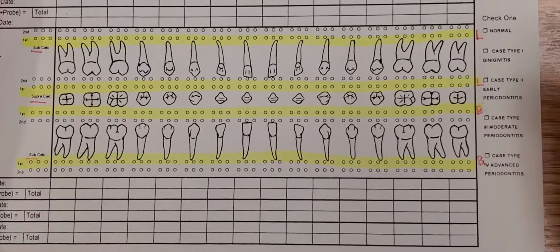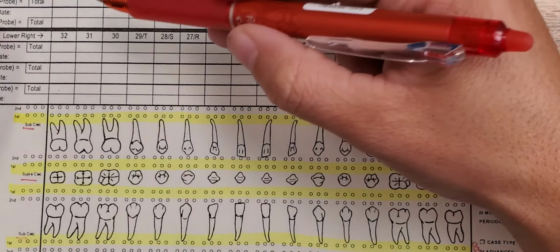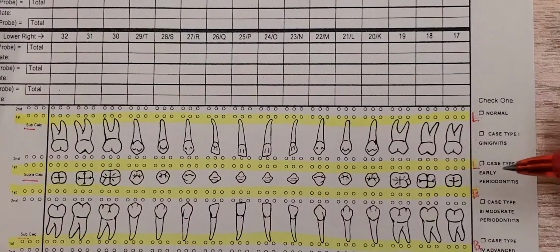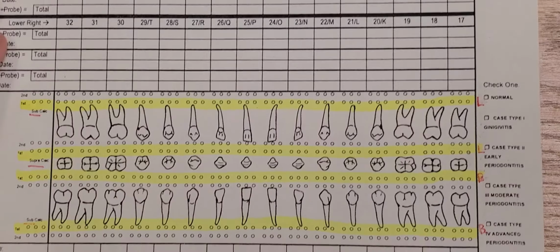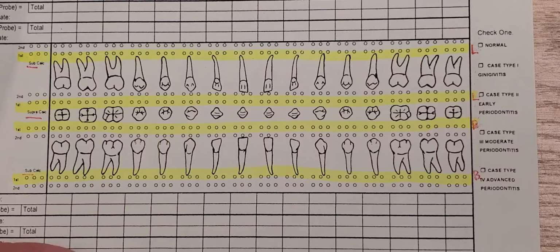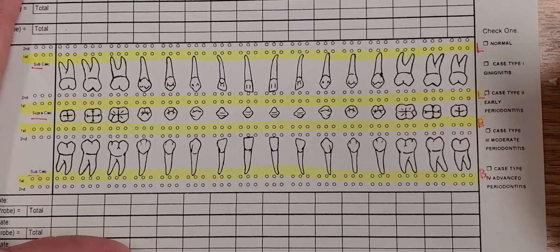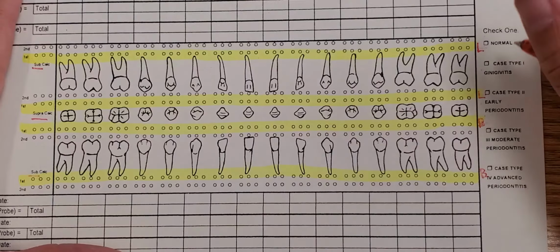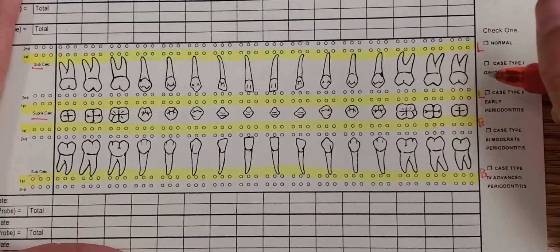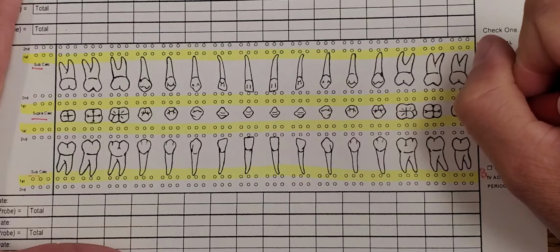When you're exploring, we're going to follow the same sequence, 17 to 32. So we're going to call out sites from right to left. Also, we're going to check for supracalculus first in each quadrant. We always fill out supracalculus by filling in the circle, regardless of the amount or size of the calculus. For example, we might call out tooth number 17, distal, buccal, supra. We would fill in this dot.